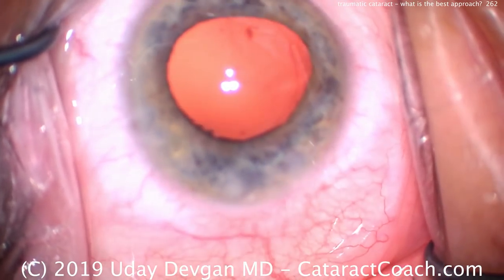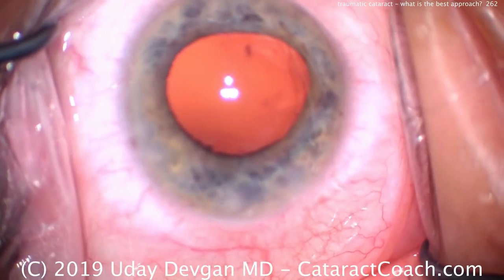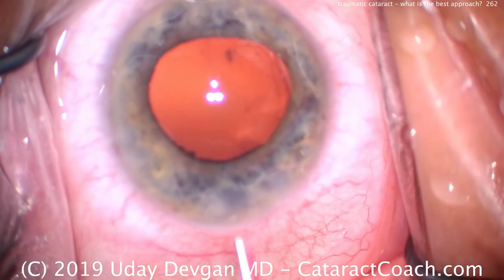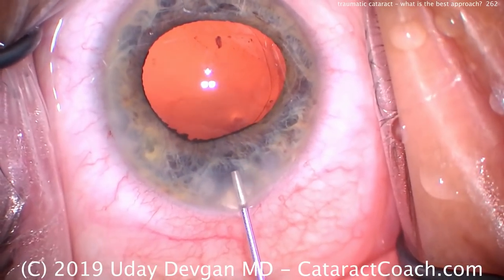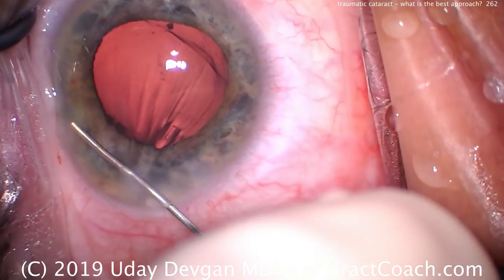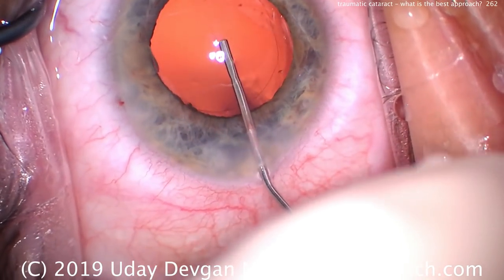We're going to fill our capsular bag, put our lens inside the bag. Now, what are the options for the lenses? You could put a three-piece lens in. Maybe if they have bad zonules, you could have some more options for suturing it later. You could put a capsular tension ring if you thought there was some traumatic zonular loss, but I don't think there really is. So I think this patient will actually do really well with a single-piece acrylic lens.